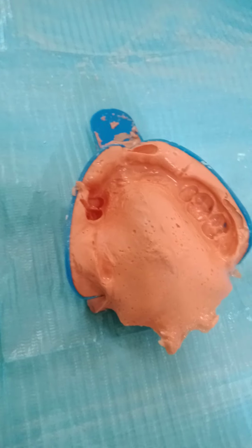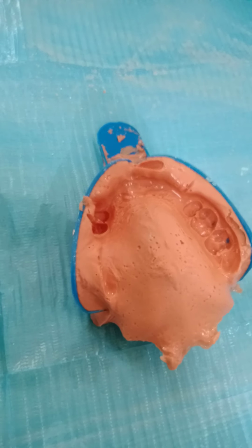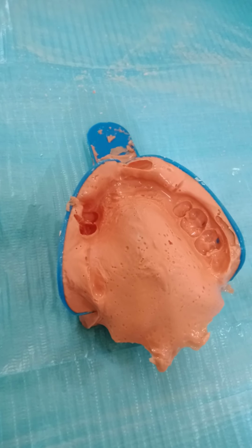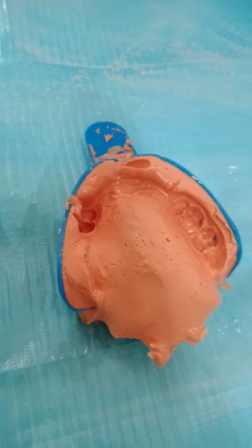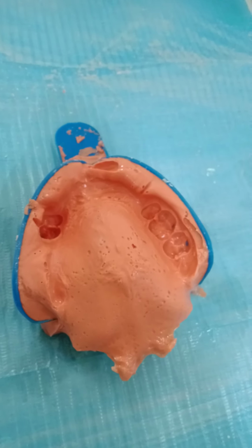Okay, so go quickly to the lab. Okay, let them pour it. Within 10-15 minutes, you have an afternoon clinic. No. Okay, we are still in the beginning of the clinic. So at the end, you will have a tray and you will do a secondary impression. Okay, thank you.